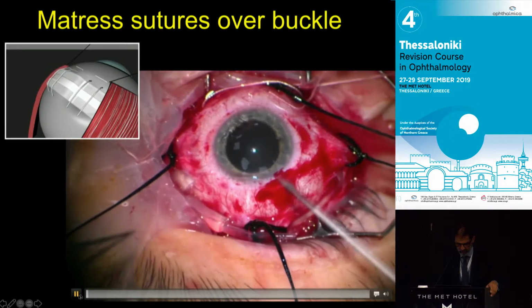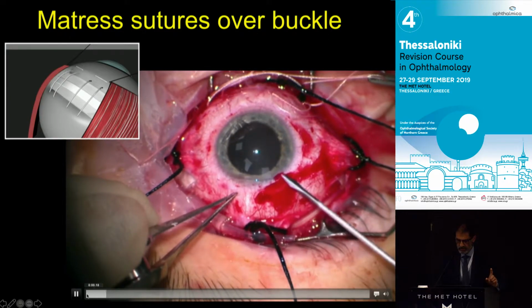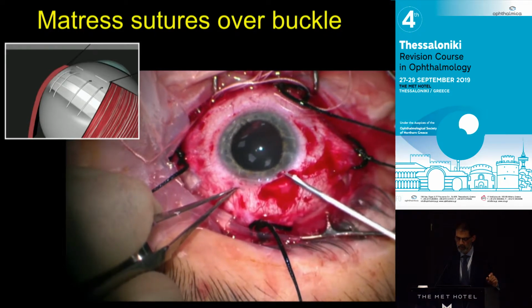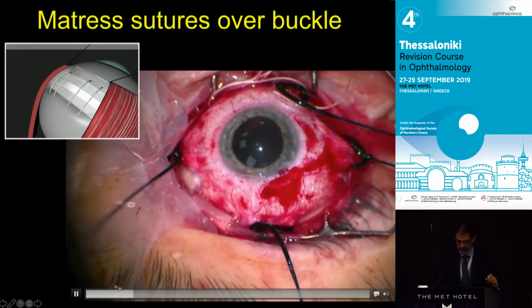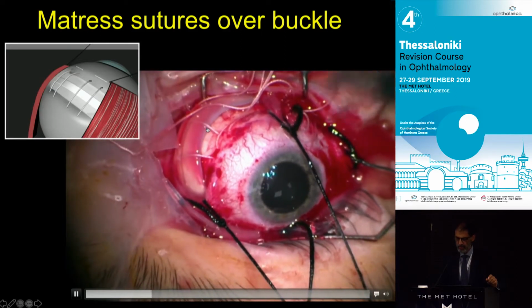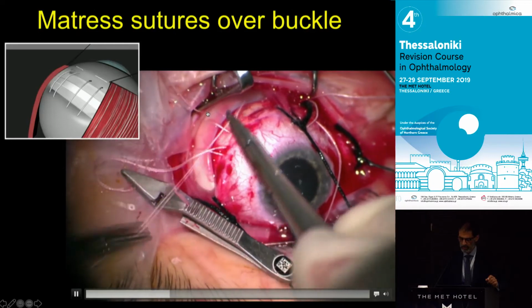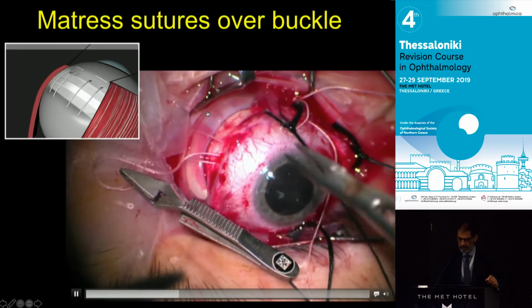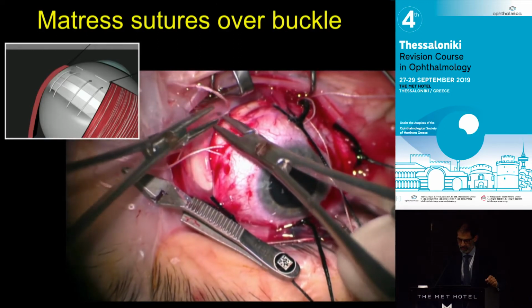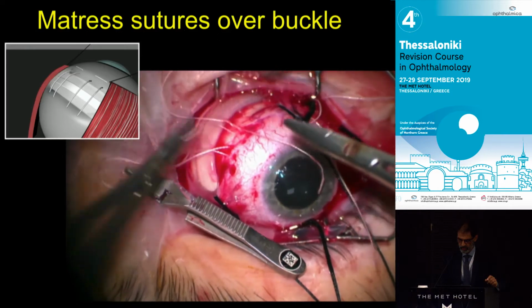I'm just going to advance this even faster than it is. Make some space first. So I do the paracentesis or the drainage before you pull the buckle into indentation. So that's what that was. Actually, this is going pretty quickly. There's the buckle threaded through, and we tie a triple throw here to indent. I'm only going to do one of these. So here it is. I need to show you because you always lose that end. So I just wanted to show that in real life.